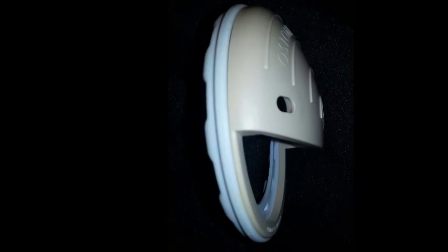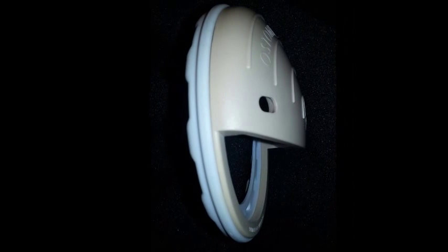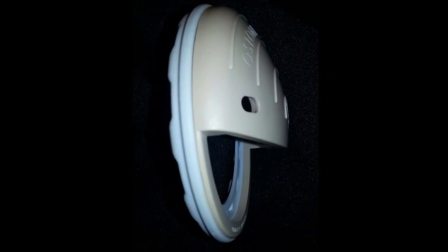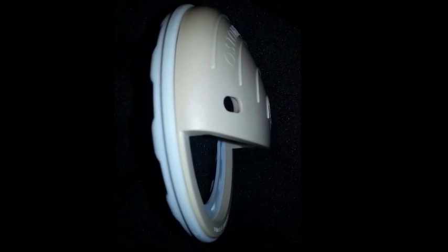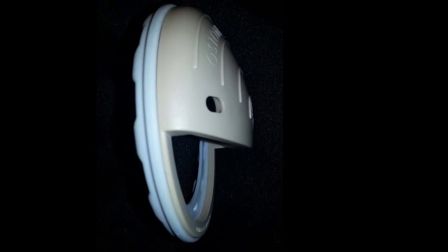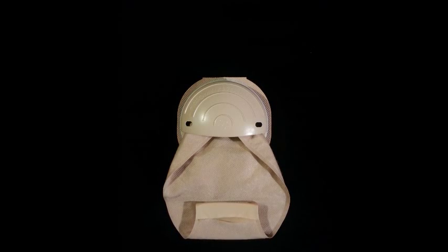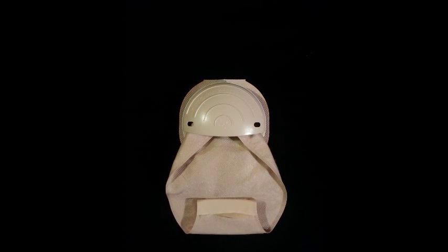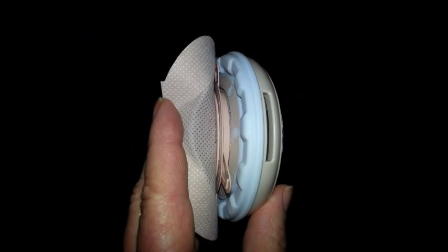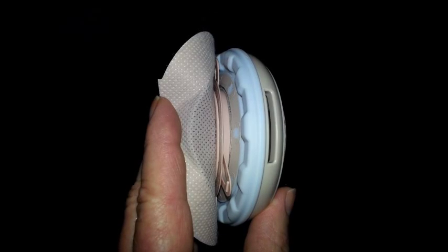The short cup protects your stoma while allowing flow, even while sitting, and offers protection from waistbands and inadvertent bumps while restricting gas from ballooning the pouch above the waistline. A vent at the top is for filtered pouches.